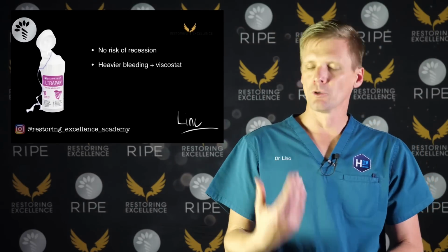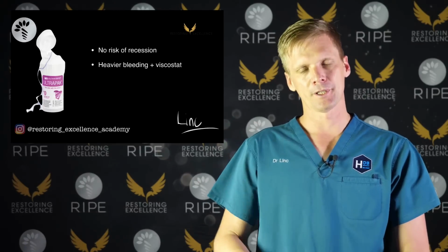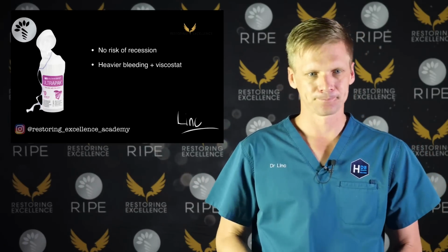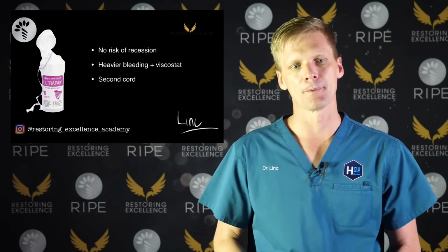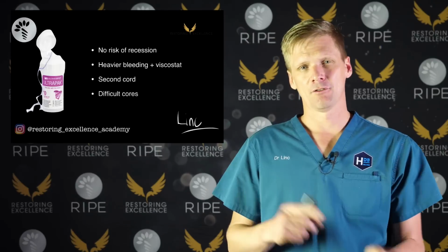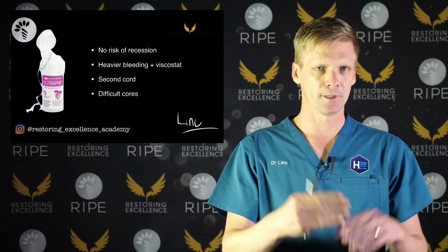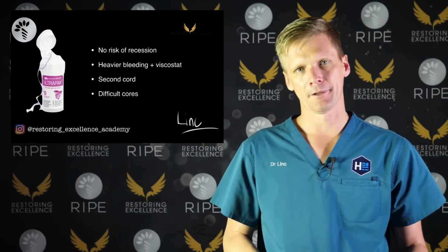If I'm doing impressions with thick cord, I'm always going to pack a thin cord first. Otherwise, as soon as you pull the thick cord out, either the tissue collapses or it starts bleeding. And when I'm placing two cords, the second cord is always a thick one. I do sometimes use Teflon instead of a thick cord. So instead of having a second cord, I'll have Teflon over the top of the thin cord. I'll explain why. Pretty much anything that's difficult, I'm going to use a thick cord.